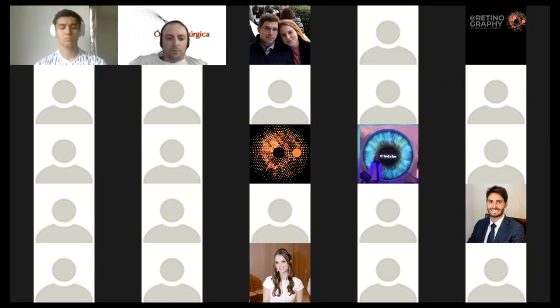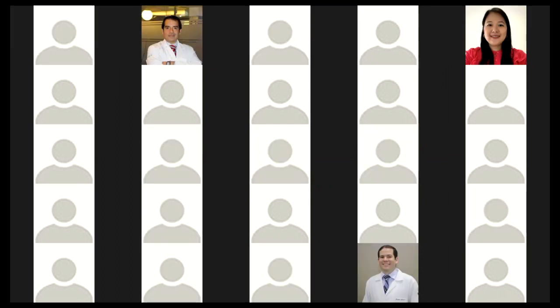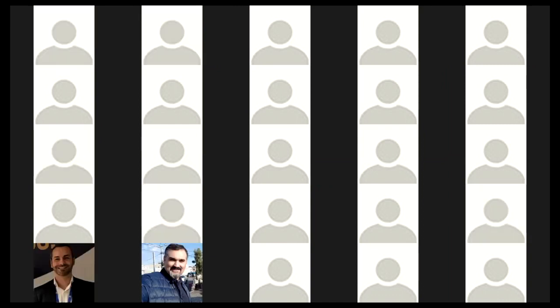Yeah, I think SICS is not useful in this situation because it's a very soft nucleus and it's already partially in the vitreous cavity in a post-vitrectomy eye. Any instruments going in the eye, especially when you make this large incision here, you're going to cause some pressure to have the nucleus, whatever's left of it, fall back. This patient was young, only about 50 years old.